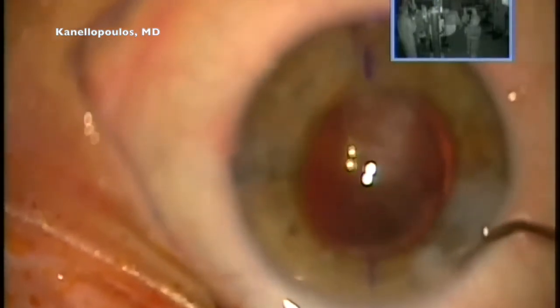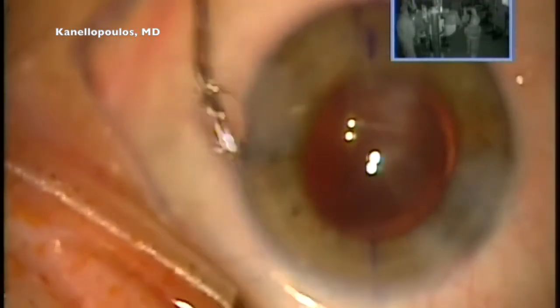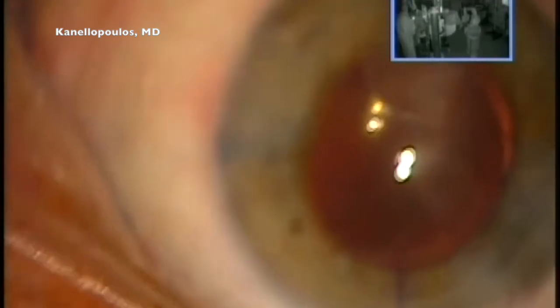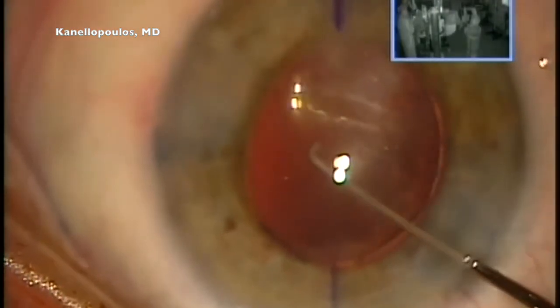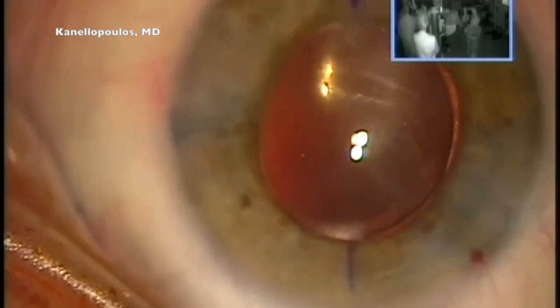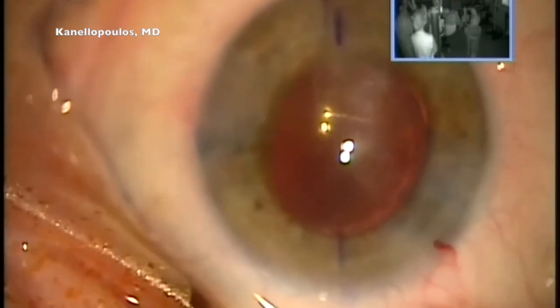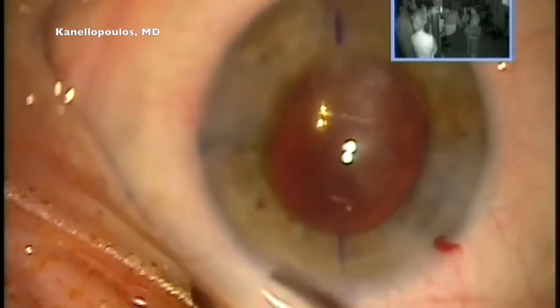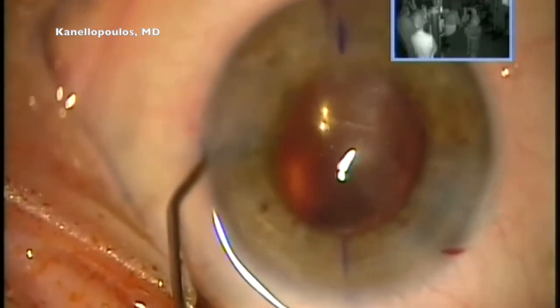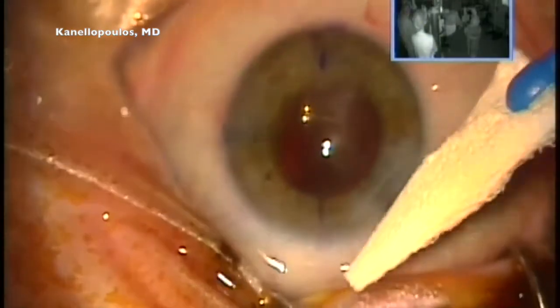And outside the US, we have the ability to use a T2 lens that has a low amount of astigmatism and complete this refractive target of emmetropia, and with zero or if anything a slight with the rule astigmatism I'm using here after hydrating the incisions and accomplishing a watertight anterior chamber, recentering the lens to the exact markings that we placed for the 82 degrees, and using Miochol, acetylcholine, to attain miosis and trap the lens and the capsular bag behind the iris. Our procedure is done.